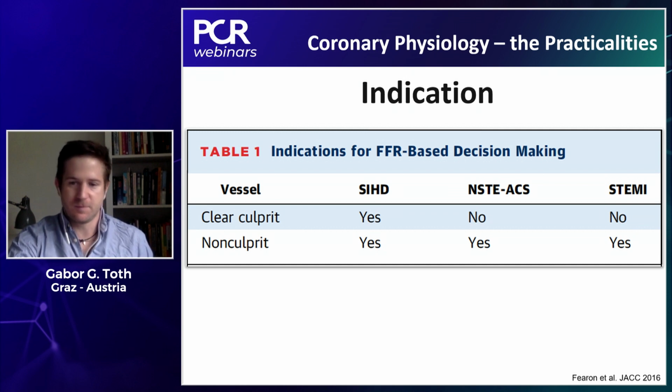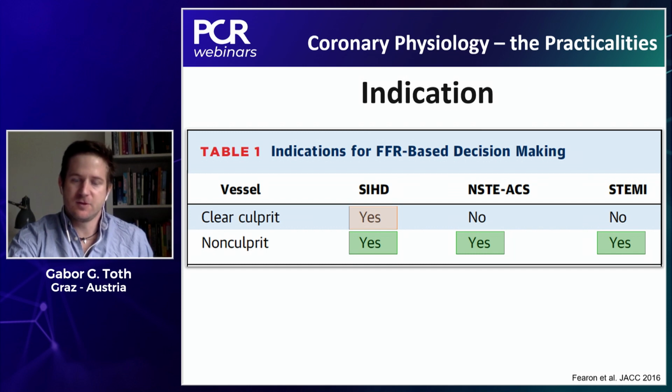from Bill Fearon from a couple of years ago, saying that coronary physiology is definitely indicated for stable coronary artery disease, especially if there is no clear culprit.